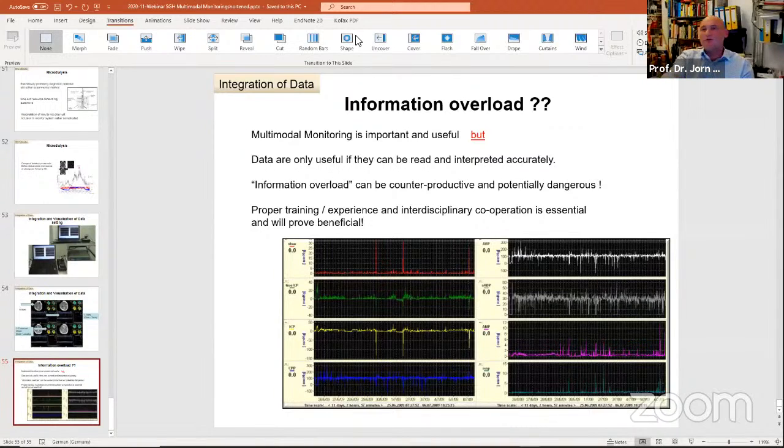And for this, PO2 monitoring is useful, because we started this a couple of years ago, and I've got a load of literature. If anyone wants that, I can mail them the list. I took it out because otherwise the talk would have been even longer, but there's loads of literature showing that the PO2 goes down first, and it drops and stays down for a while, and only then the ICP goes up and shoots up, and then your PO2 is useless because it's down, it's 0, it's 5, something like that, and then you have an infarct.